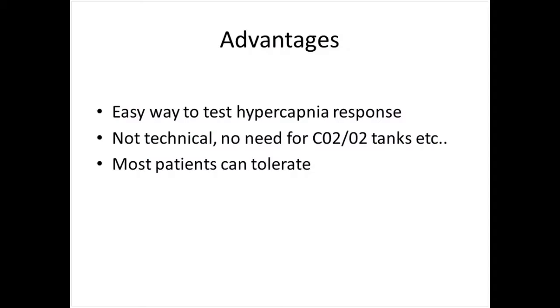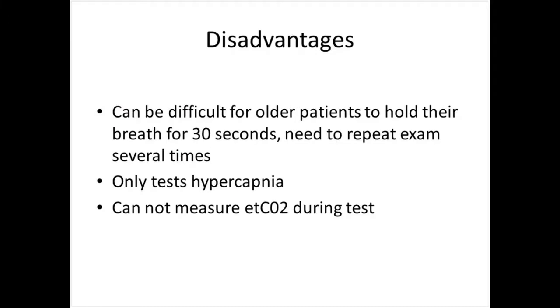So this is an easy, convenient way to test for hypercapnia response. It's not technical. There's no need for CO2 and O2 tanks or end-tidal monitoring equipment, and most patients can tolerate it. But it can be difficult for older patients to hold their breath for 30 seconds, and sometimes you may need to repeat the exam several times for accurate results. It does only test for hypercapnia, and you cannot measure end-tidals during the test.